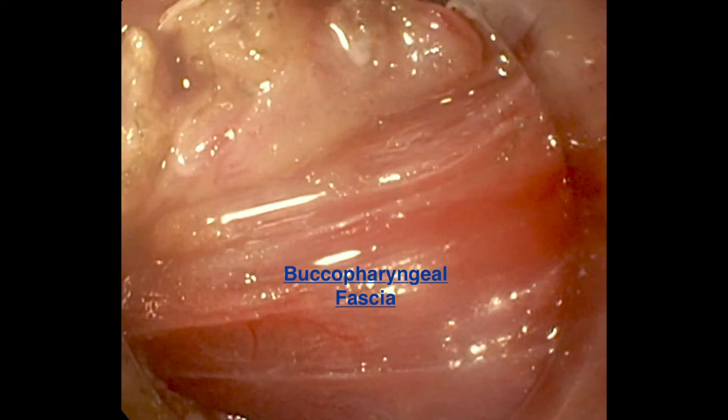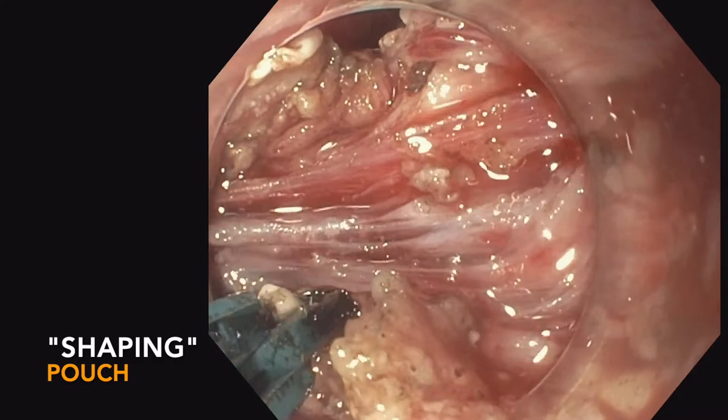Just below the buccopharyngeal fascia remains the retropharyngeal space, the alar fascia, and then the danger space and prevertebral fascia. Remember, we're dissecting posteriorly, and there are only thin layers below the buccopharyngeal fascia.